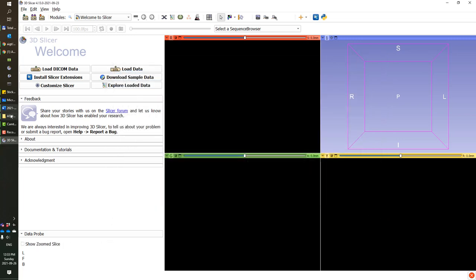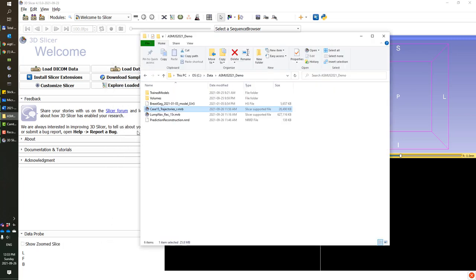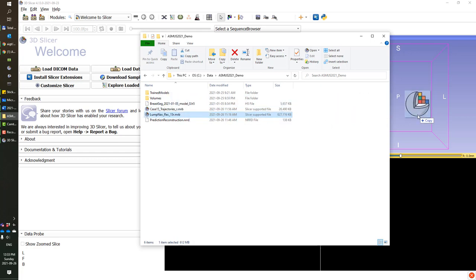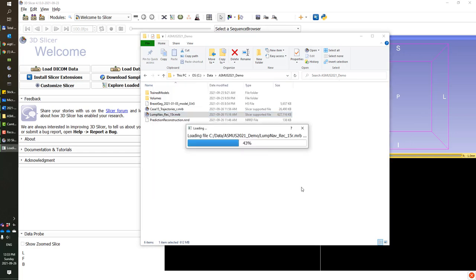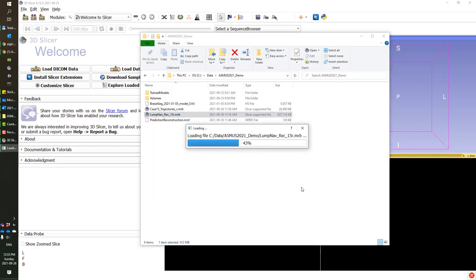I have already done that, so I can just load the data for this demo. First, I will load an ultrasound scan that was captured before surgery when a localization needle was already placed inside the tumor.